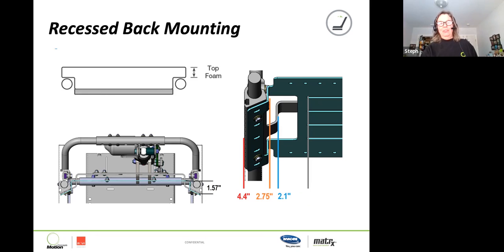If you've not ever done this, a typical recess rail cut is where you're determining how far inboard from the edge, and how far the depth that you want to go back. And I know in my younger days, I would have always thought about doing rail cuts like this on a back that was being mounted into a manual tilting system, or a power tilting only system. But nowadays we see so many requests to do this in recline. So again, we have to make sure that we are having the minimum amount of material anterior of the pivot point to really make this work.